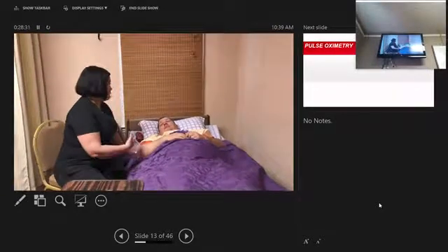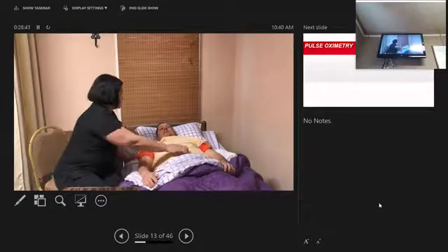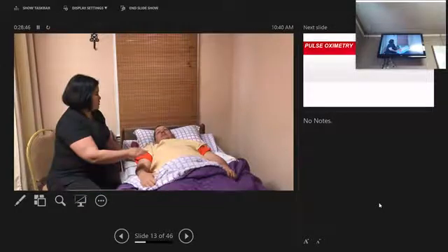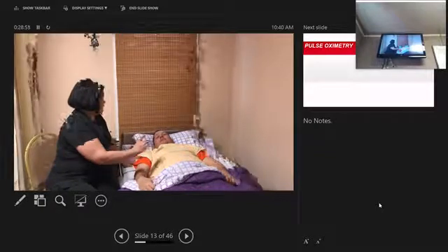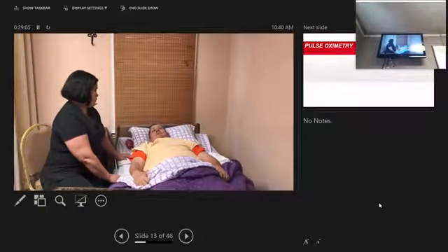Pull your privacy curtain. Have a seat next to you. For testing purposes, we are going to tell you that we are counting your respirations. I'm going to just expose your chest so that I can see your chest rising and falling.